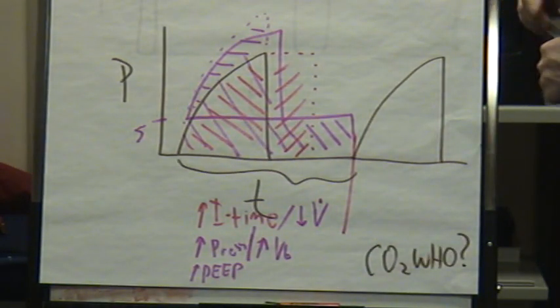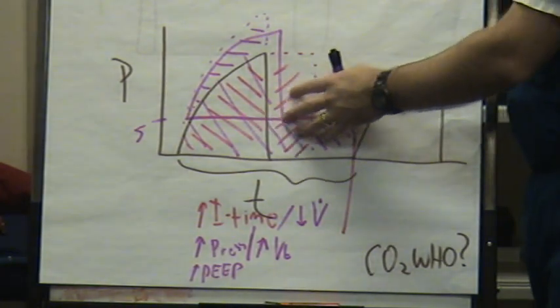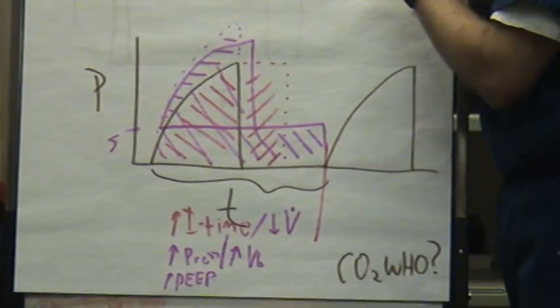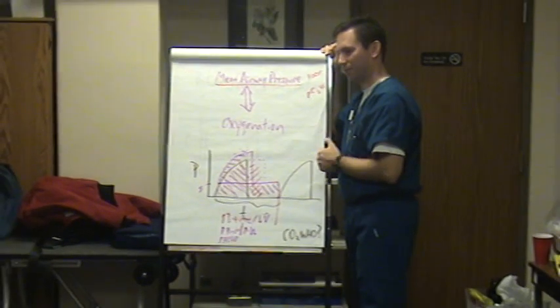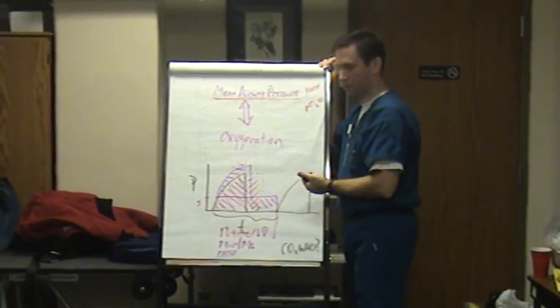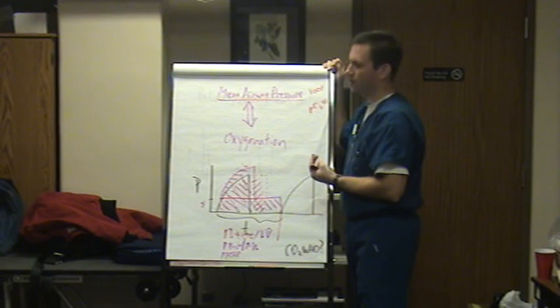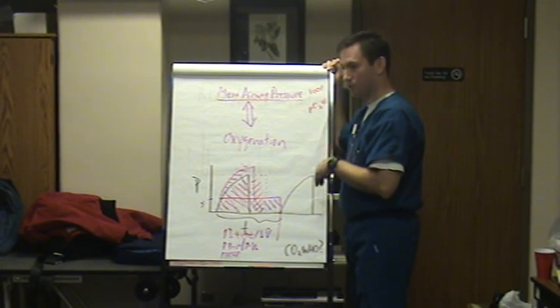Now remember from slide 1 though, anytime I'm changing these, you'll think I'm lying to you if you change it and it doesn't work. But anytime I add pressure in the chest, what do I need to reconsider? From the very first slide we talked about. That you're pressing on the heart. Pressing on the heart. So what do I need to reevaluate every time I increase this pressure? Cardiac output. Good. I need to assess cardiac output, either by cap refill, blood pressure. If they have a Swan in, you can look at that. You can see if their SVO2 is dropping.